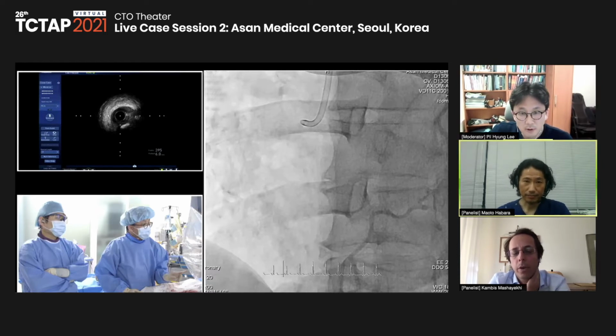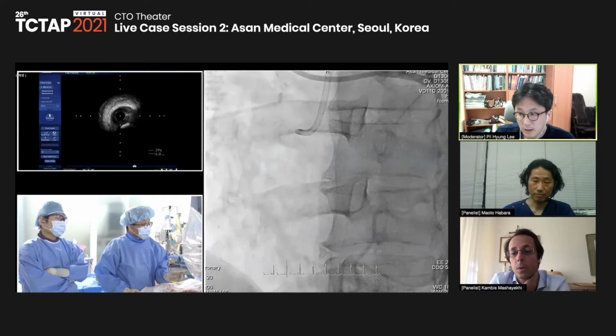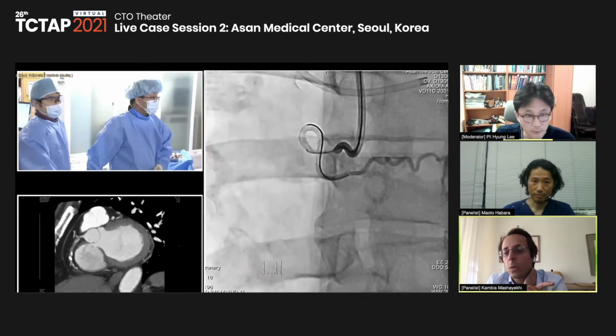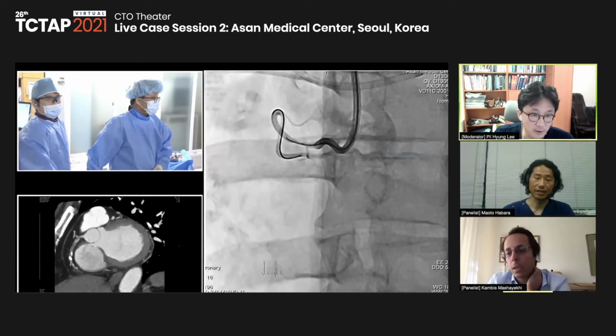Yeah, I absolutely agree with the 8 French. First I used the Gaia 3rd, and then I changed to the Confianza 9, and I actually failed to puncture the proximal. Do you have the Gaia 3 Next or the Gaia Next? No, we don't have the Next series. The same for us. Okay.